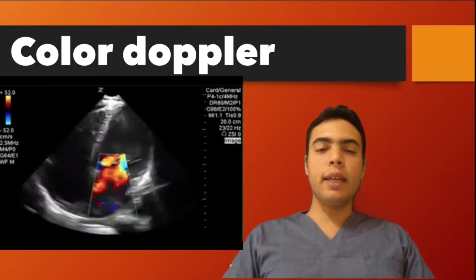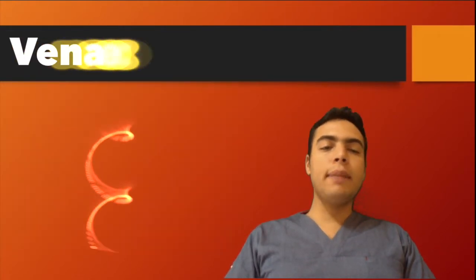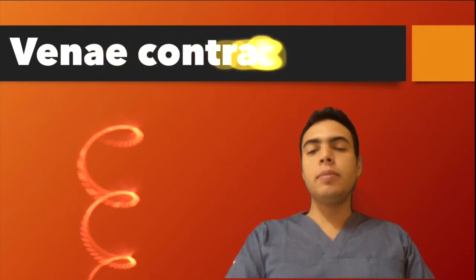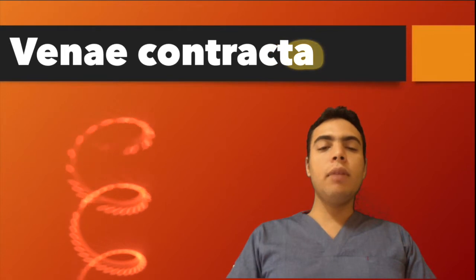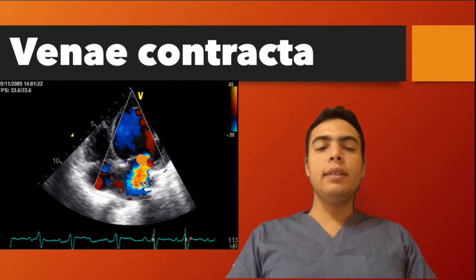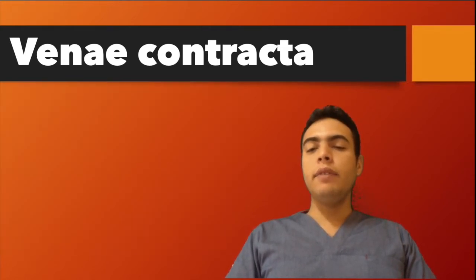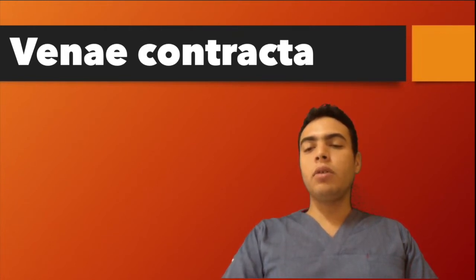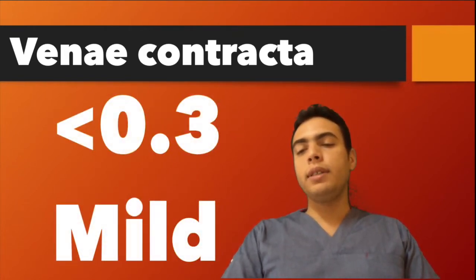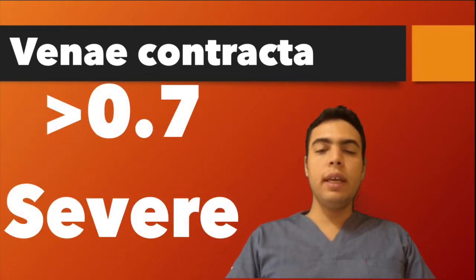The most important step in assessing regurgitation severity is measurement of the vena contracta — the narrowest part of the mosaic color jet, measured here by 2D planimetry. If it is less than 0.3 cm it is mild regurgitation; between 0.3 and 0.7 cm is moderate.